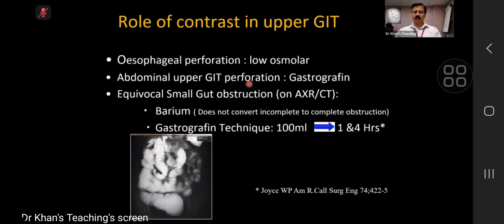Sometimes if the perforation is not visible, we can use Gastrografin, particularly in a post-op case, such as surgical anastomosis leak and things like that. Here, if you say barium, it's a blunder. You are unsafe. So remember that. You have to use Gastrografin there.